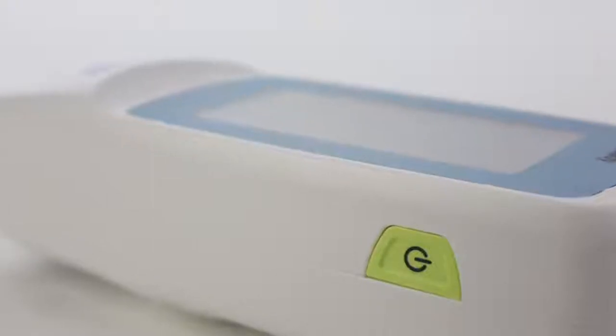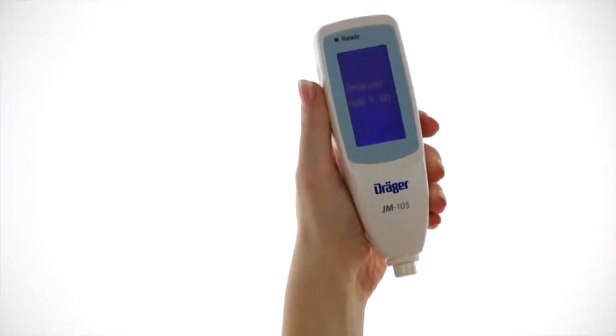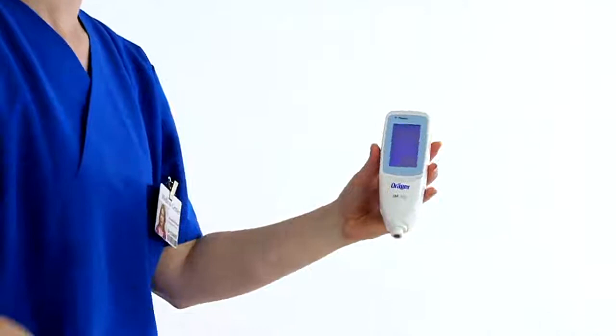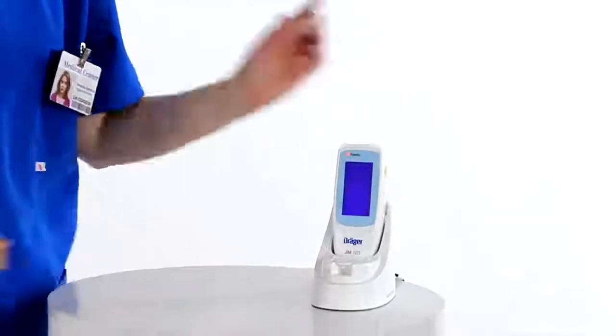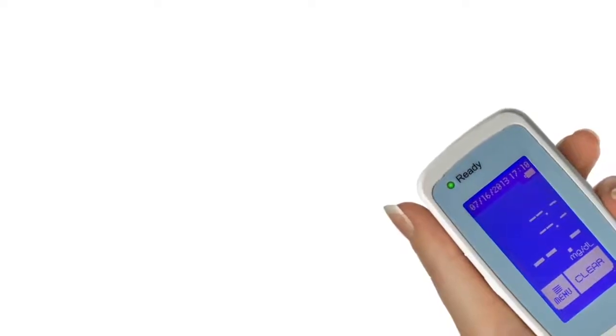Before using the JM105, it's important to become familiar with the features, controls, and touchscreen display. A green power switch is located on the side of the unit and turns the JM105 on and off. However, it is not necessary to turn the power off before replacing the JM105 in its docking station. After the JM105 has been in the docking station for 1 minute, the screen goes blank, but the power remains on. When the JM105 is removed from the docking station, a green ready lamp shows that the power is on and the JM105 is charged and ready for use.